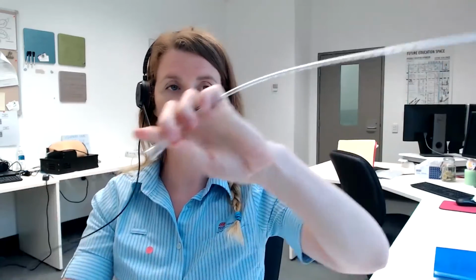You have straight small catheters. So this is a small catheter that you might put in, and that's just a straight one. Again, that would just be used for air. I don't think anything else. And then you have your larger bore catheters. So this is one of the smallest of the large bore catheters. I'm just going to take this introducer line out so you can actually see.